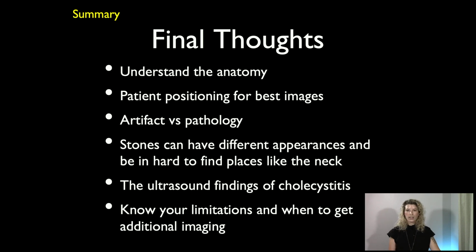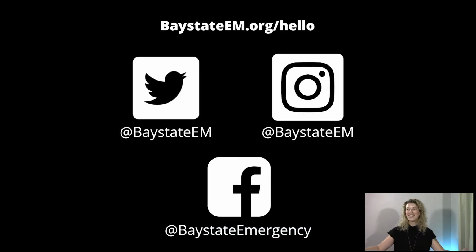Understand the different findings of cholecystitis. Know your limitations. Know when to get advanced imaging. And again, you gotta practice. You won't learn anything about ultrasound without practice, practice, practice. You gotta do it all the time. So that's the end of the lecture. Does anybody have any questions?